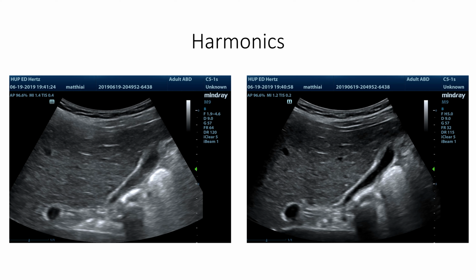The harmonics image ignores all of this sound range, and it only listens for 5.0 megahertz sounds, which are twice the frequency of the central frequency of this sound range. It doesn't work out to the middle number average between these two, but just go with me and accept that the central frequency of this frequency range is 2.5 megahertz.